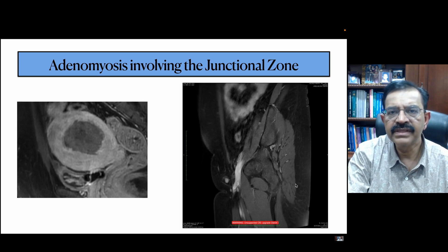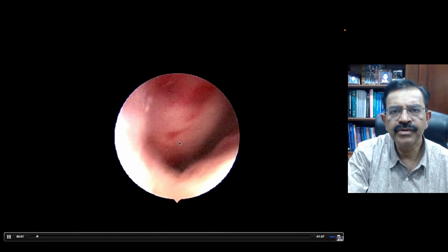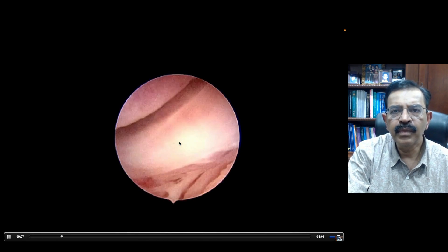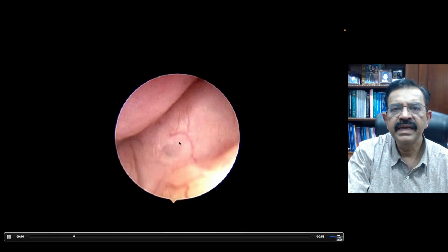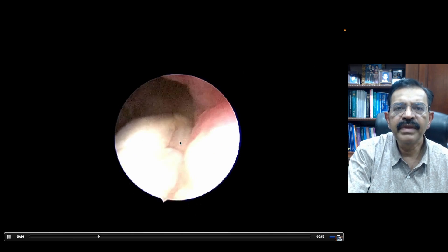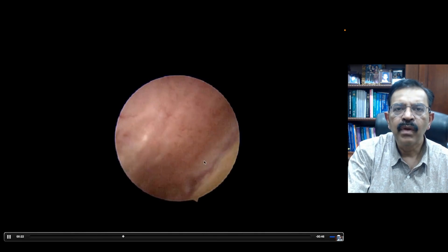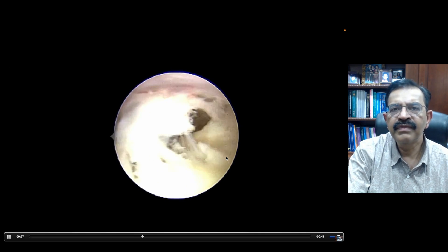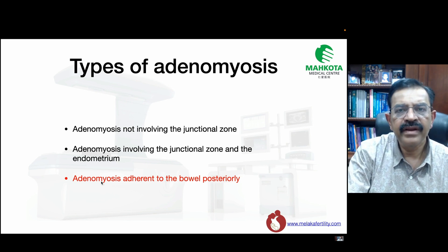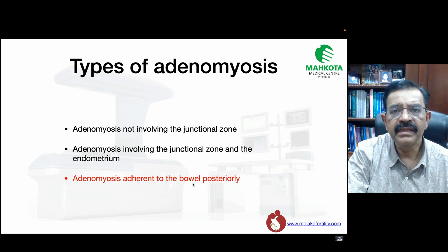Here is an example. After three months, you can see that the adenomyosis has involved the junctional zone. I performed a hysteroscopy on this patient whom I had ablated up to the junctional zone, and you can see that the posterior wall was affected by the ablation. These are the challenges for patients who want to get pregnant. If the endometrium is already involved, we must wait until all the necrotic tissue has come out before the patient attempts to conceive or undergoes embryo transfer. When the bowel is adherent posteriorly, we must also be careful not to ablate it accidentally.